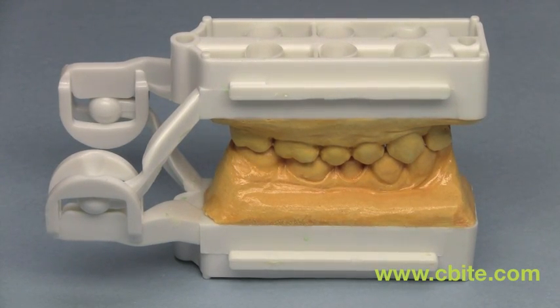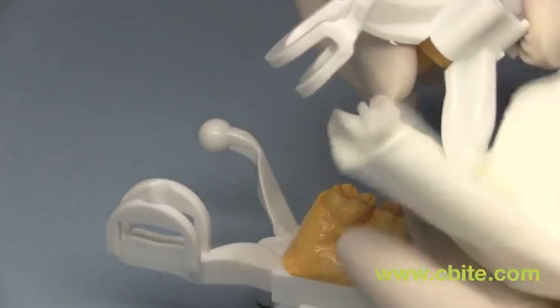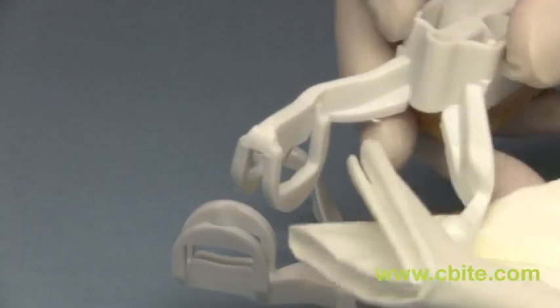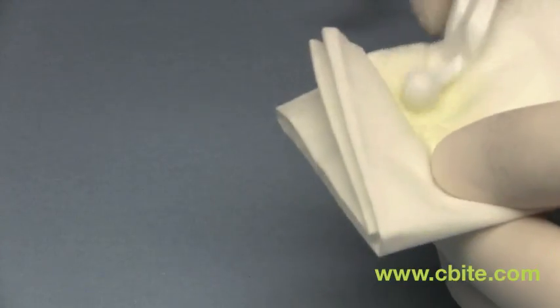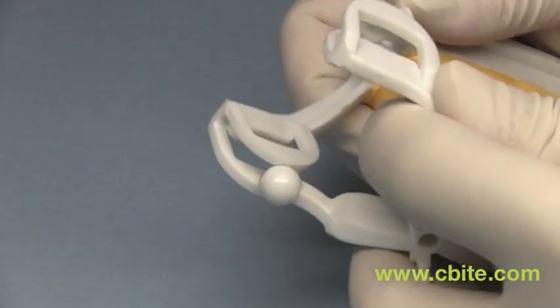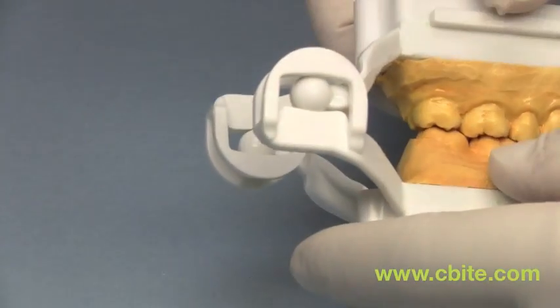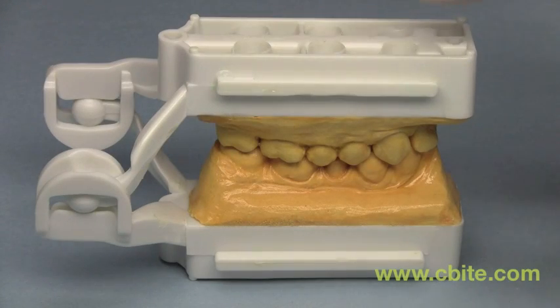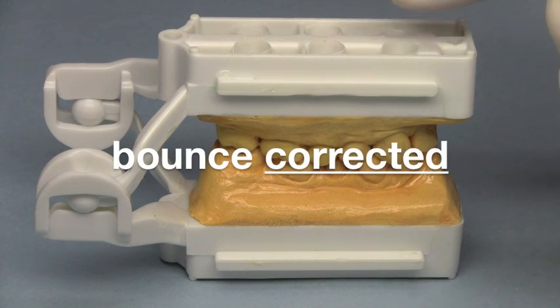Unless an incorrect bite is obvious, it's easier to start by lubricating the ball and clasp assembly. Let's see if there's still a bounce. No more bounce, the problem is fixed.